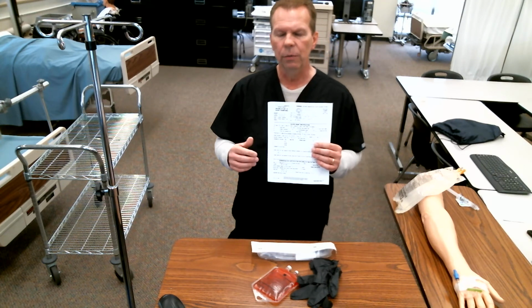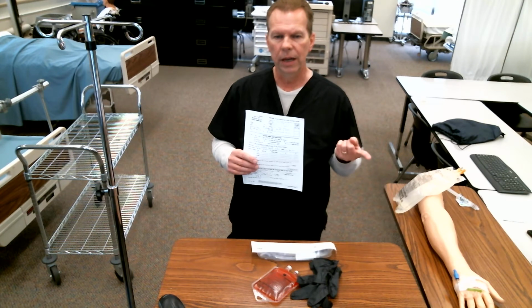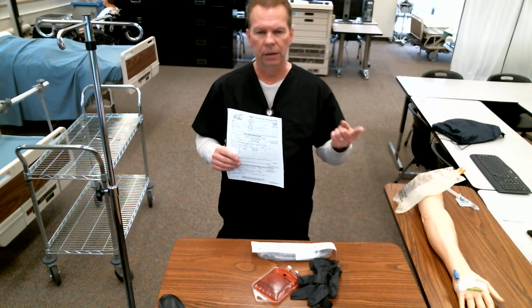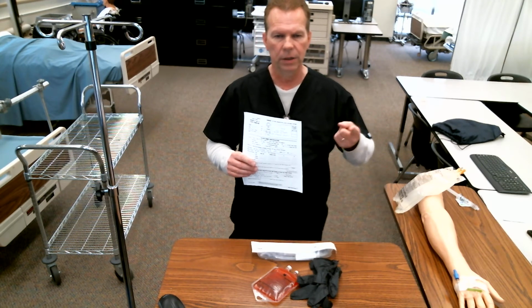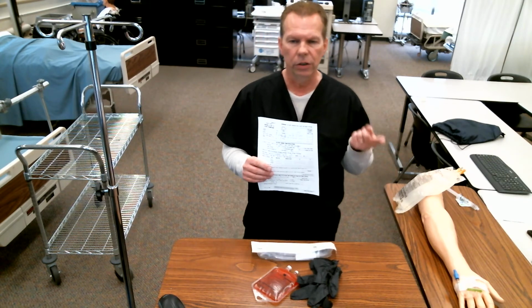And so information on this form that you are going to check is what is the blood product that I'm giving? Is it whole blood? Is it packed red cells? Is it plasma? Is it albumin? Is it platelets? What am I giving? So I want to make sure of what I'm going after.